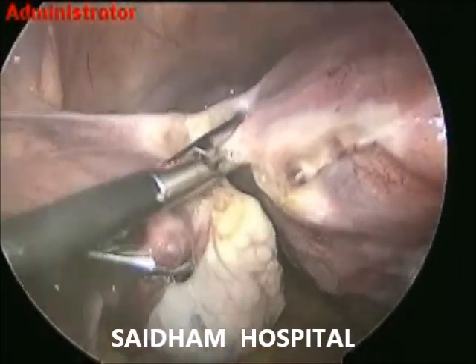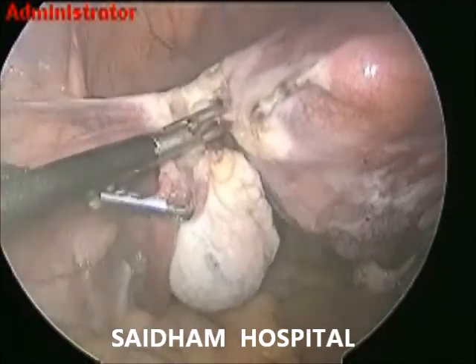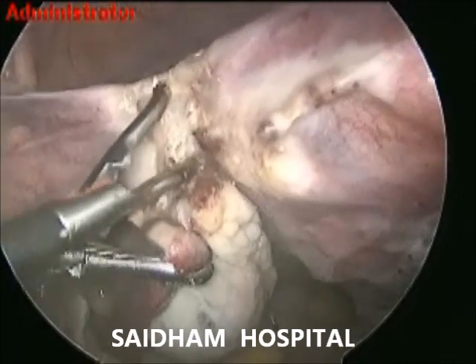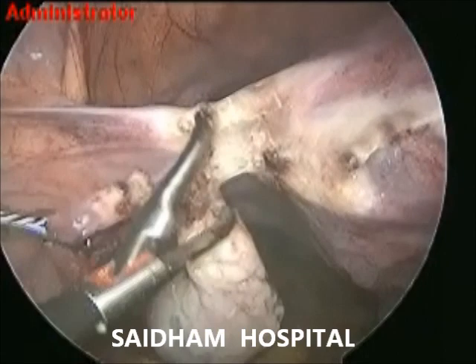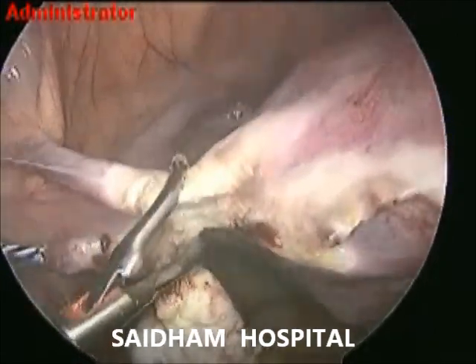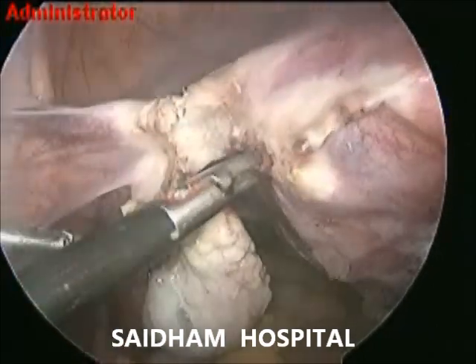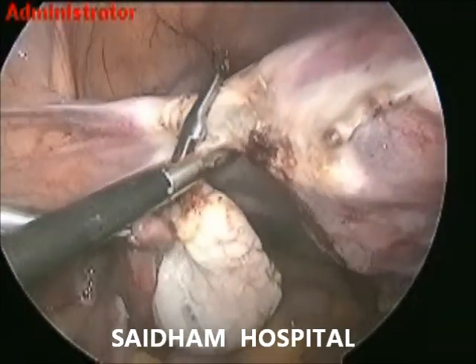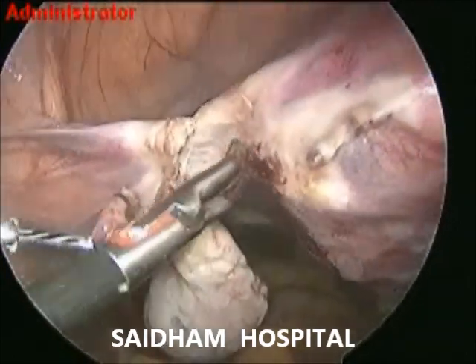As in our Saidam technique of TLH, I have taken the cornuals near about 1.5 to 2 cm away from the uterine surface. Good coagulation is needed. I am doing the surgery with advanced bipolar, a bipolar cutter. The same instrument can coagulate and cut.